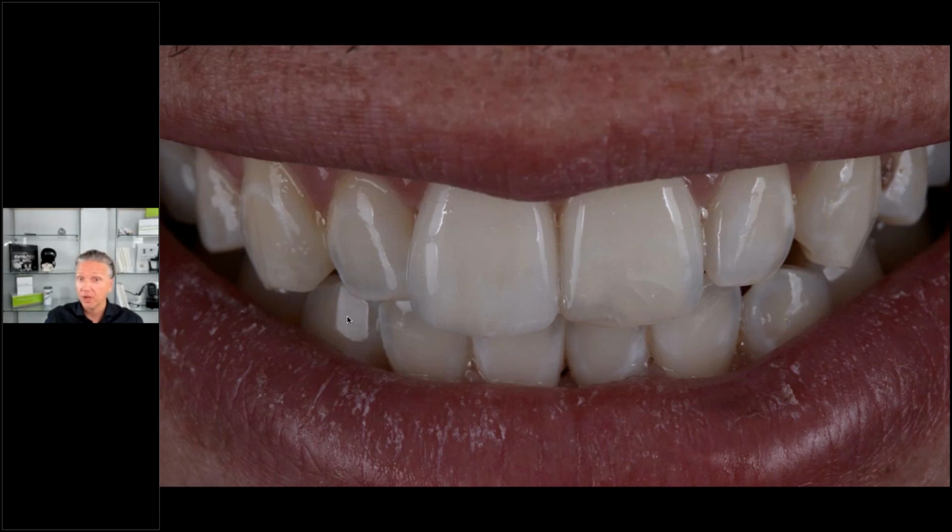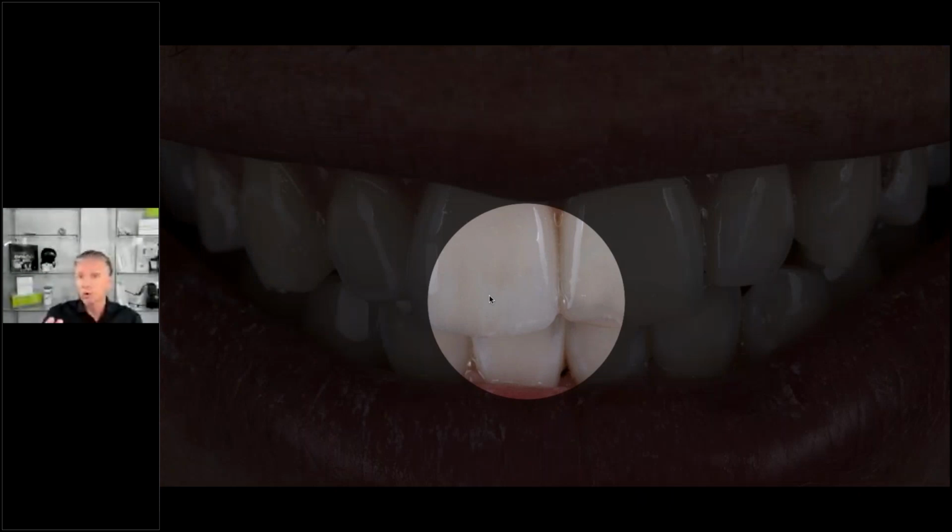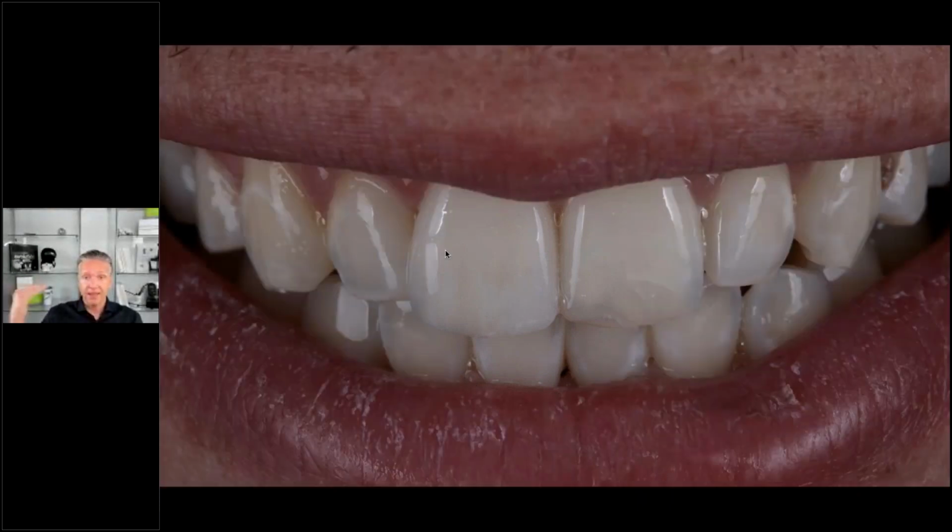The patient didn't want to have that copied, and we asked him, should we do a veneer maybe on number 9 tooth to have two veneers matching each other? He didn't want to do that. I heard he's now ready to do it. But besides that, it was a pretty good outcome. You don't see any graying. That's why I want to show this here, in this area where basically nothing is supporting light transmission. Everything is blocked nicely from the dentin from behind, and it has a very natural appearance. So that's very important to understand.